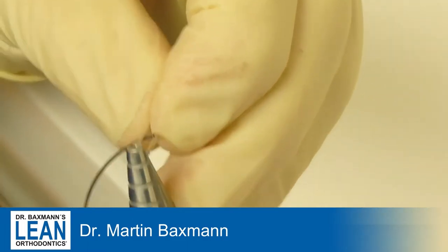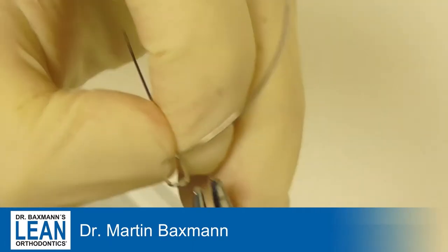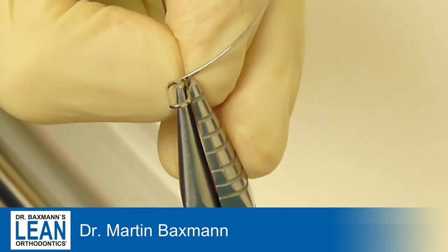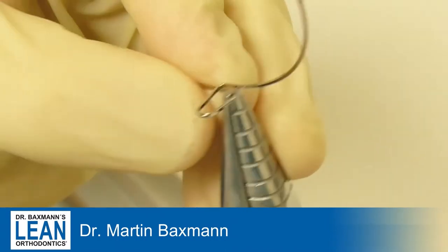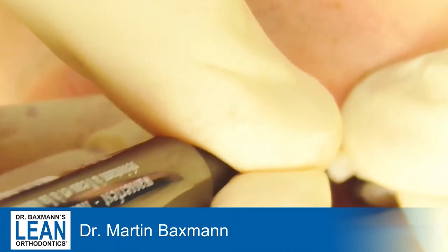I make a mark distally of the tooth — that's where the loop has to be, between the two and the three. I go downwards apically about eight millimeters and form a U of a size of about three to four millimeters.